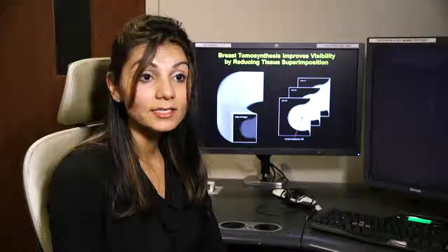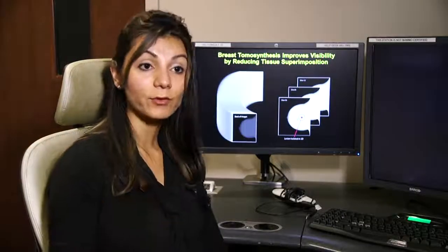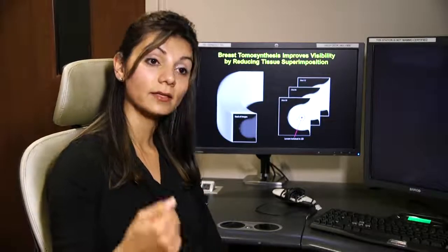One big difference is you're going to be squeezed in any sort of mammogram, 2D or 3D, just the way it is. You lie down, you lie back for an ultrasound room. Ultrasound has zero radiation. You lie back, the technologist comes in and takes pictures of your breast.